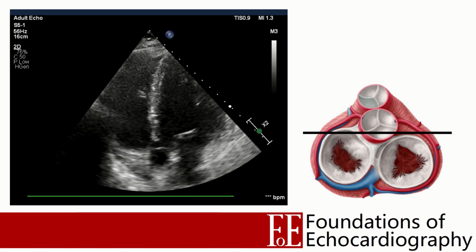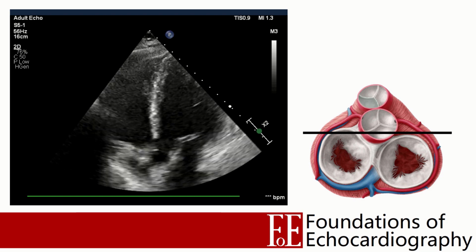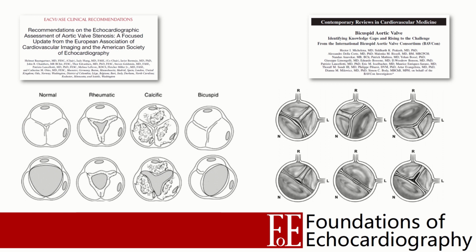because the flow of blood is much better aligned here with the ultrasound beams than we see in the parasternal position. Once you've identified the aortic valve, note the thickness of the leaflets, whether there's any additional calcification or thickening, and where this occurs, and whether the leaflets open freely during systole, or whether there's restriction that may be a sign of aortic stenosis.